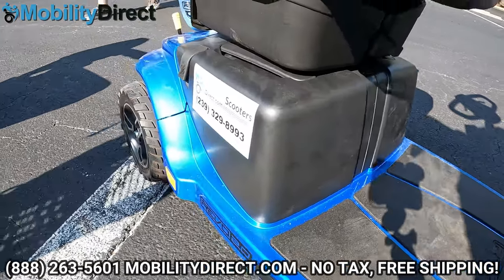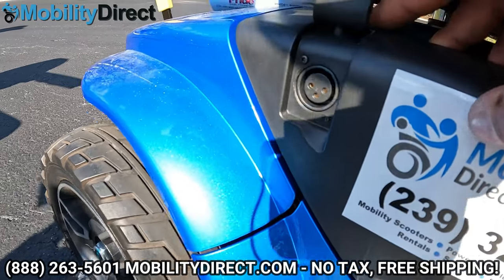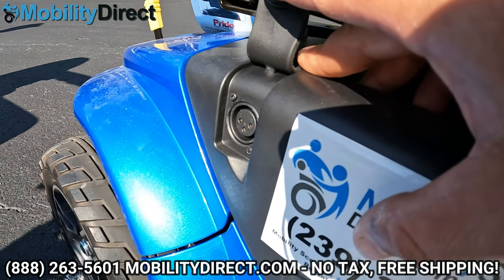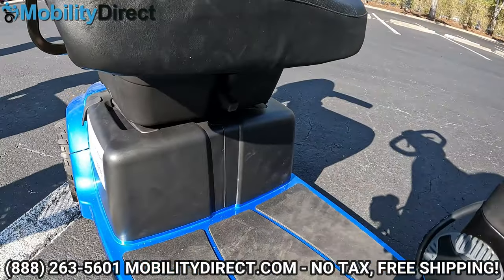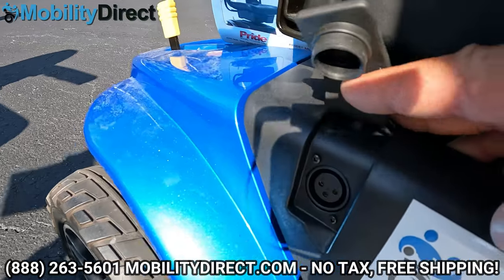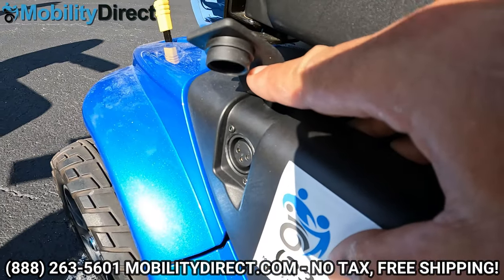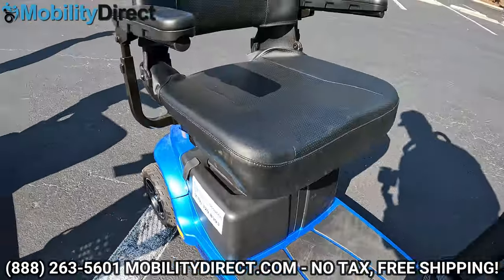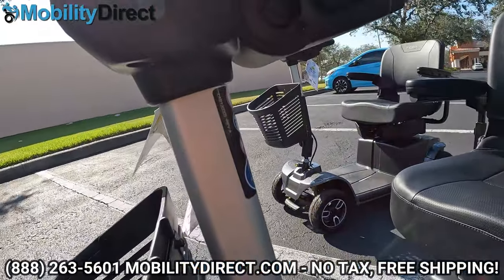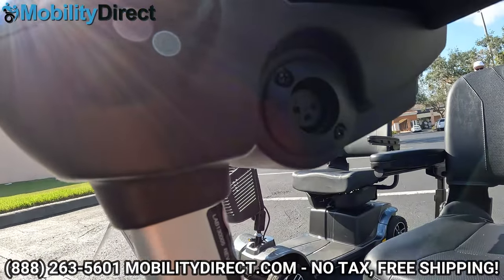Something else worth mentioning is that you can actually charge the batteries when they are disconnected from the scooter. You take them out, stack them together, and as long as they're connected together off the scooter, you can charge with the charger using that off-board charging port. You also have the charging port conveniently located by the handlebar on the left side, so you don't have to bend down to reach it.